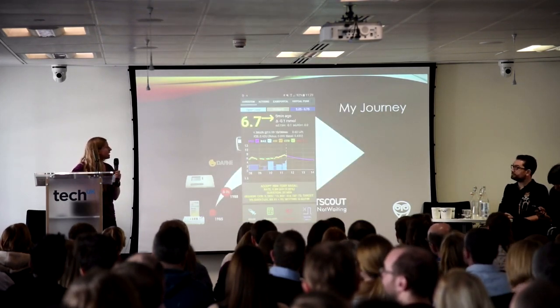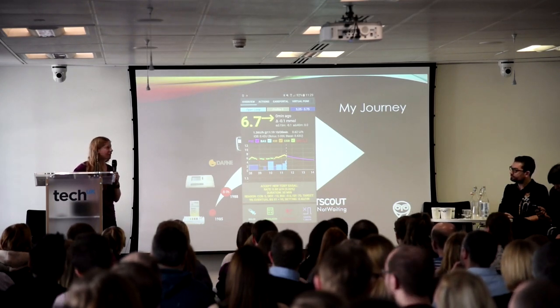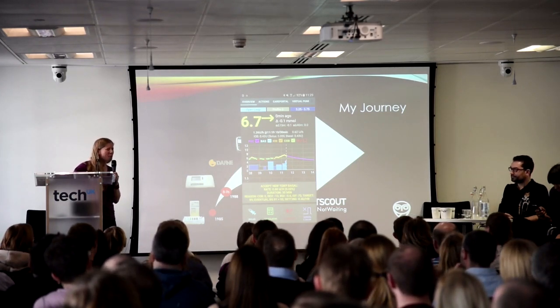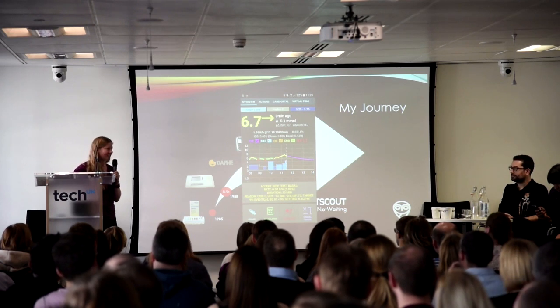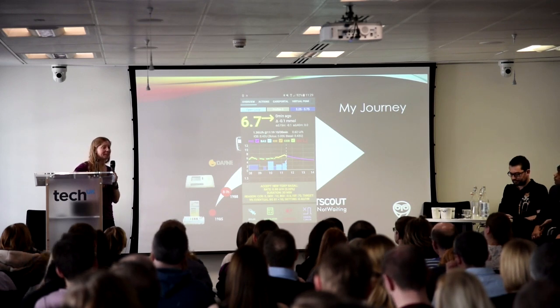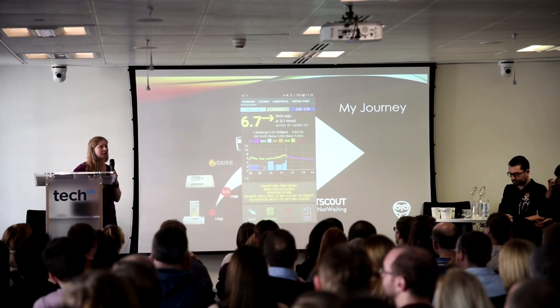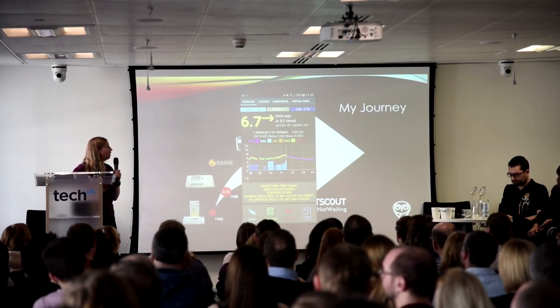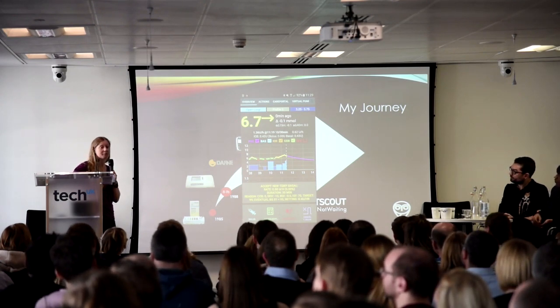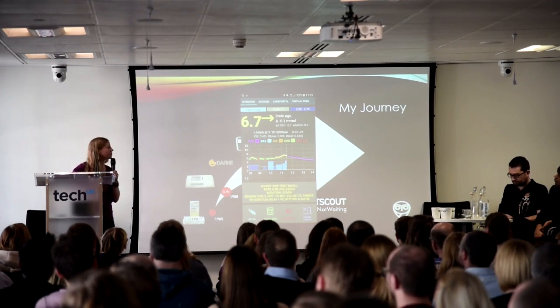I found out also through Facebook about this thing called looping. I'd read about it, and Tim has written a blog on it that introduced me to the concept, and I thought, I won't be able to do that. I don't have the tech, I don't have the skills, but maybe I'll look into it a bit more. And I found out that you can do open looping. You can get the system to tell you what it thinks you need to do, and you tell your pump to do it. As you can see there, I would never have thought of reducing my basal when I was 6.7, because to me 6.7 seemed fine. But actually, it knew that I was likely to drop later and that that reduction was needed.